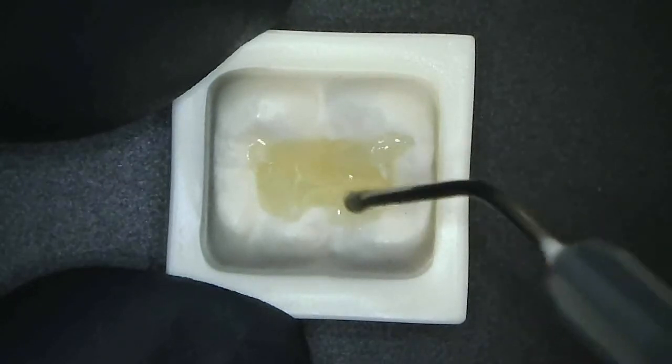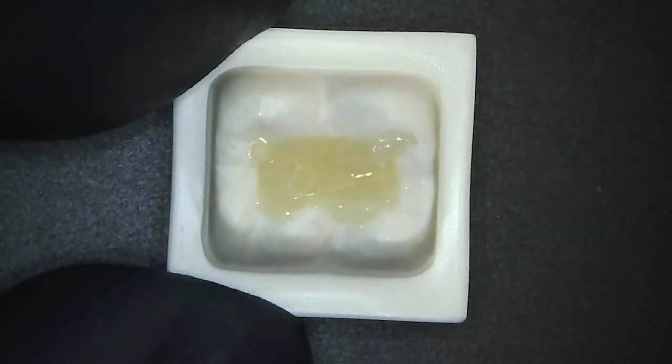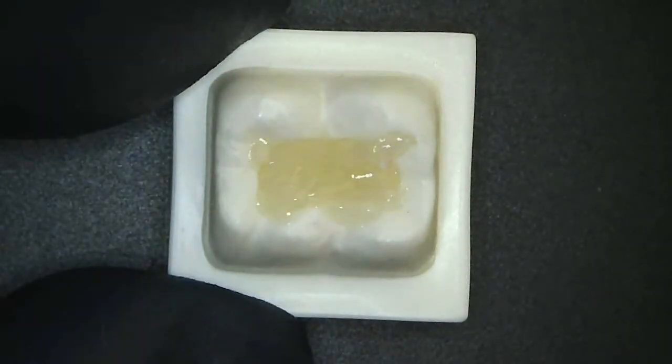And again, bringing up a feather edge on my bevel. And light curing the complete restoration for 20 seconds, like so.